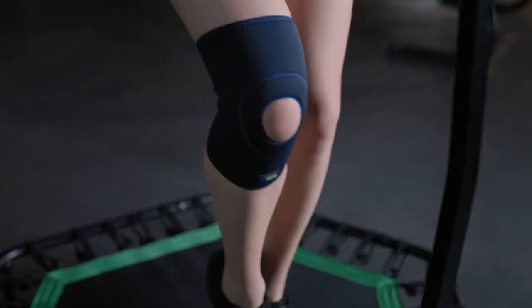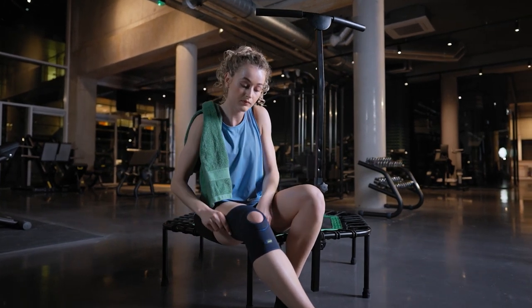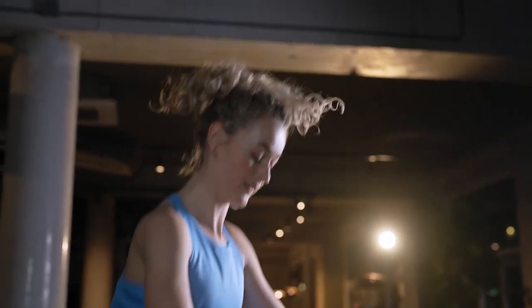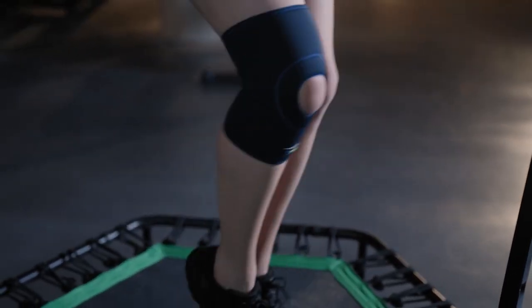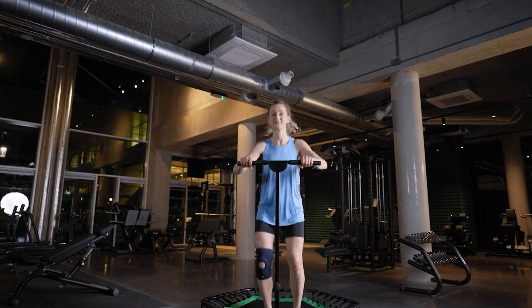Actimove's Sports Edition Knee Support is medically engineered to help pain relief after sports injuries. Made with Coolmax Air Technology for exceptional breathability — no neoprene, not made with rubber latex — it combines warmth with medical compression, and its open patella design support makes you feel secure.